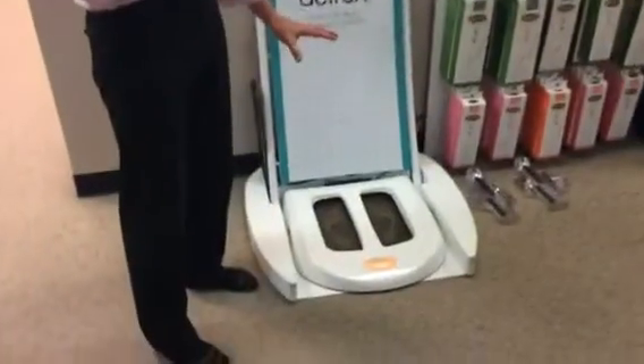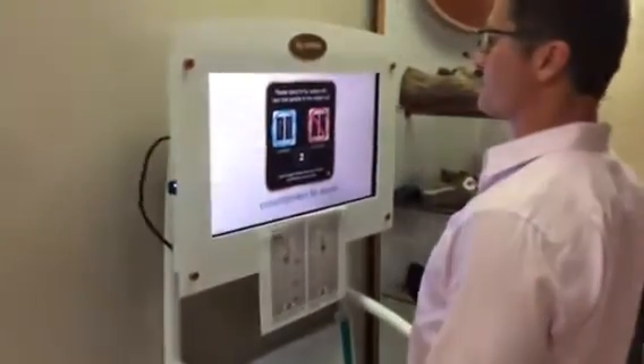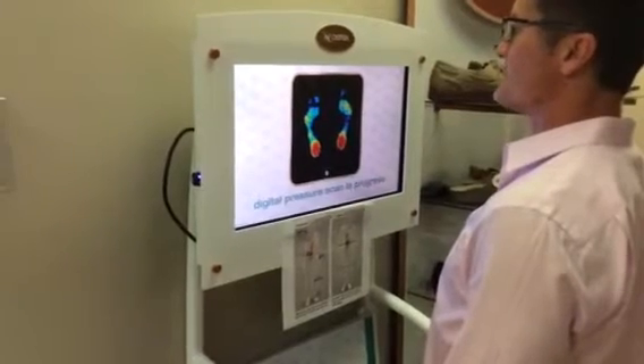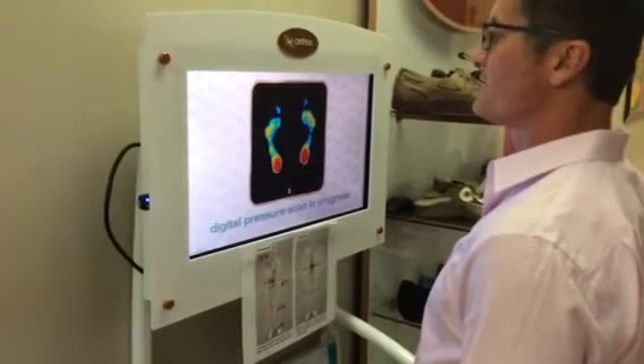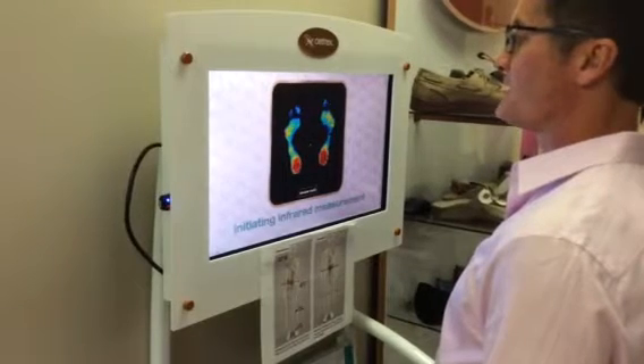There are pressure plating and sensors in this unit here, and all we have to do is have our patients step on this — you'll see there is a screen here. This is going to take a pressure reading of the bottom of their foot, and the red is obviously where they're putting a lot of pressure, and based on that we can make recommendations.